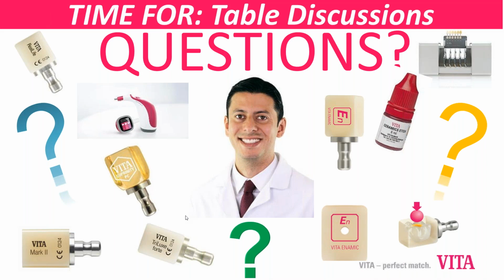Yeah, you're correct. And then how do you mill or press a veneer? And when you mill or press a veneer, do you polish, or do you always glaze? Or again, is it patient specific? Yeah, polishing is always more important than glazing, I would say.